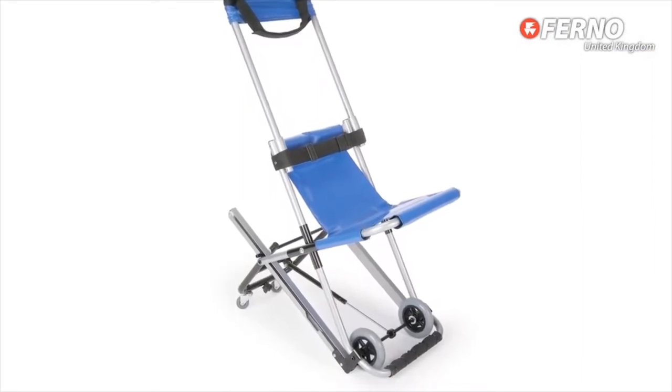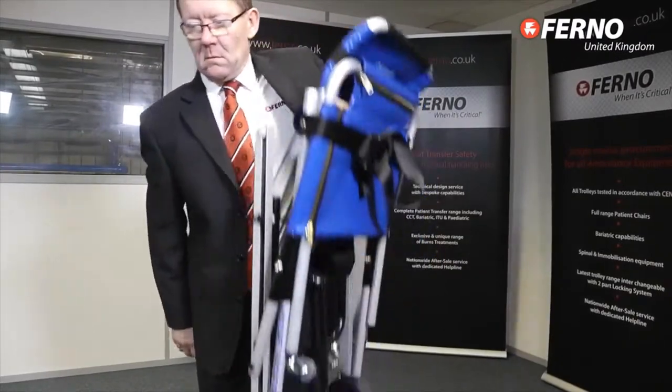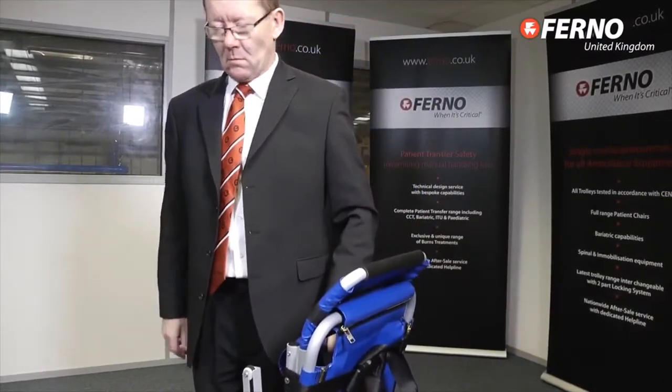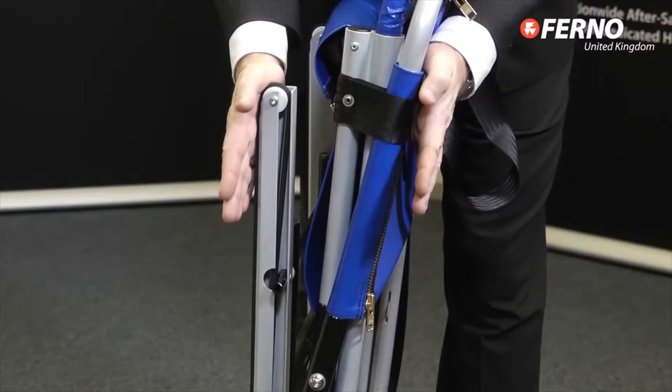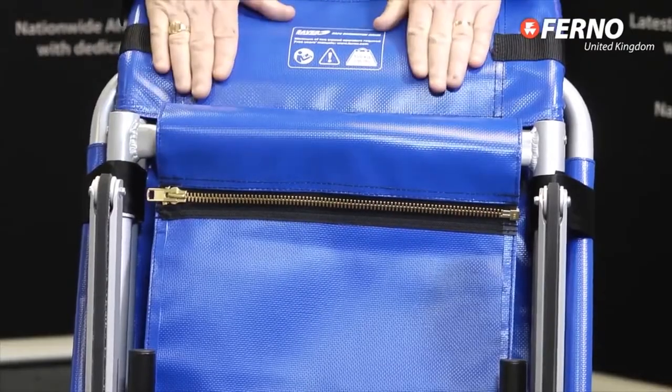Let's run through some of the chair's special features. For a start, it's lightweight — just 10.1 kilograms — and as we've already heard, it folds down to be stored safely and discreetly. For the patient's comfort, there's a padded seat, back and headrest.